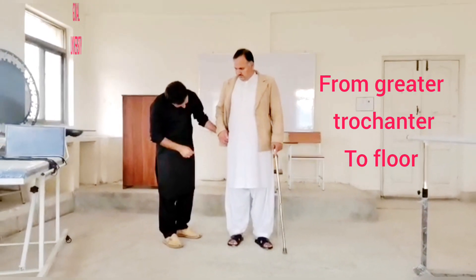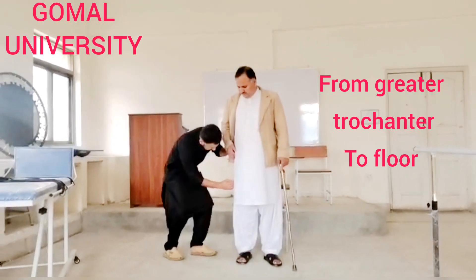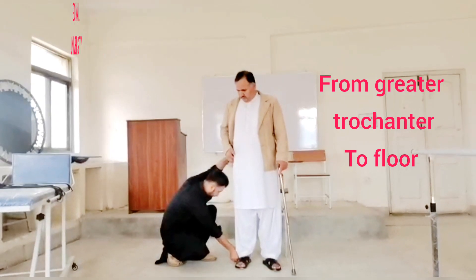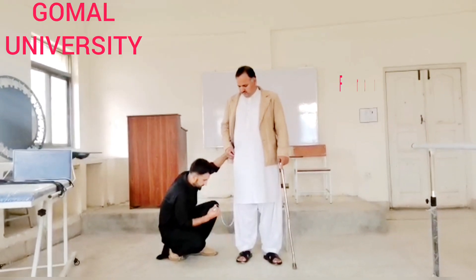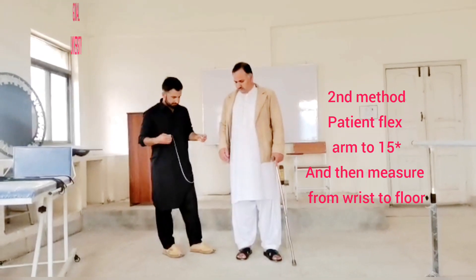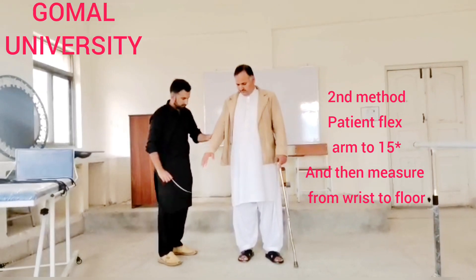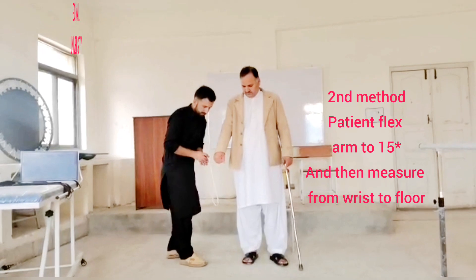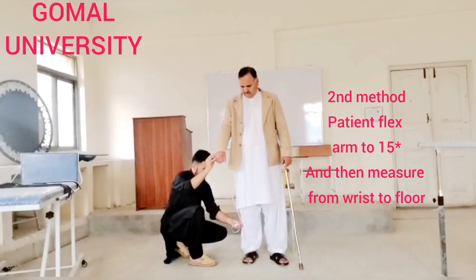Now we are going to do the practical measurement of the cane. We take the measuring tape, place the upper end on the greater trochanter of the patient, and the lower end on the floor. This gives us the cane measurement. For the cross-check method, we take another measurement: we ask the patient to stand straight and flex the elbow at 15 degrees. We place the upper end of the measuring tape on the wrist of the patient and the lower end on the floor. If both measurements are the same, it means we have taken the measurement correctly.